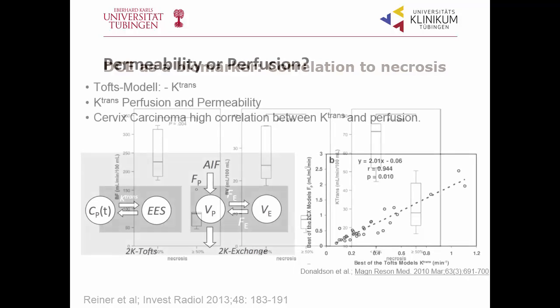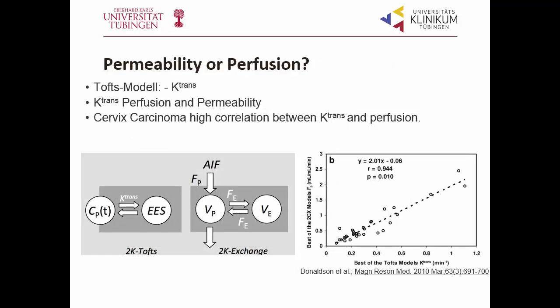The thing is, this is something Michael English has also talked about. If we use the Tofts model, it might be difficult to distinguish between perfusion and permeability.